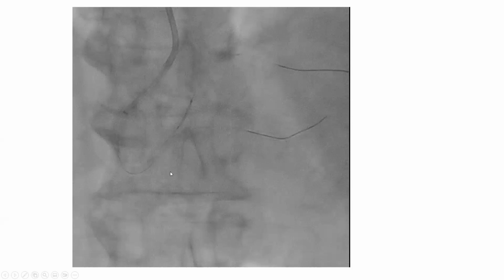The issue here is that the 7 French Guideliner does not fit simultaneous stent and balloon for nano crush technique. In fact, it could not even fit 2.5 millimeter kissing balloon. So we had to do our nano crush sequentially, meaning I stented the PLB, then I advanced the balloon and I crushed it, then I advanced the stent and I further crushed it with a stent. I did not do the stent in the PLB while a balloon is stationed in the PDA.